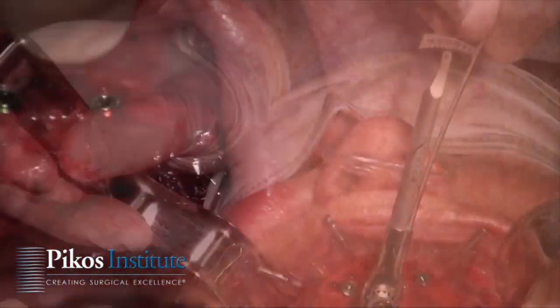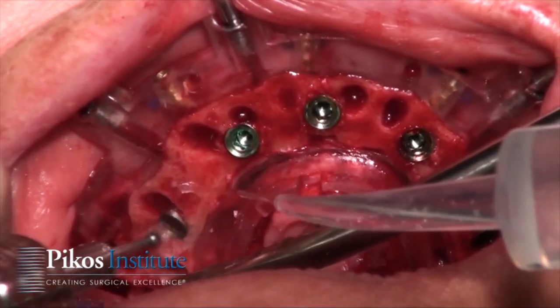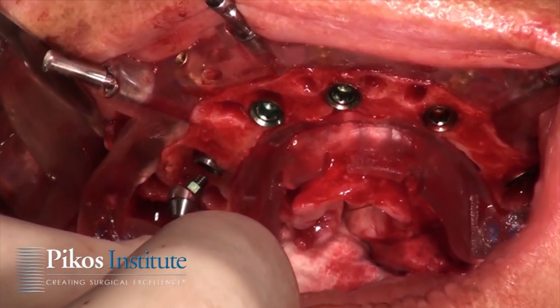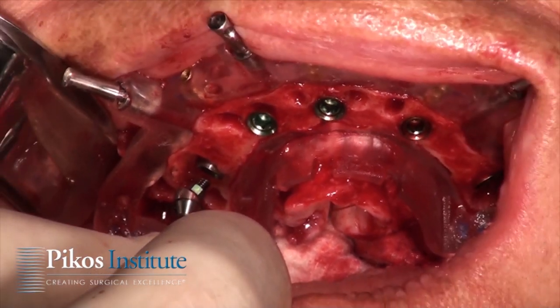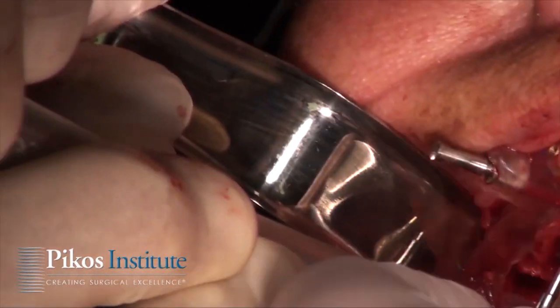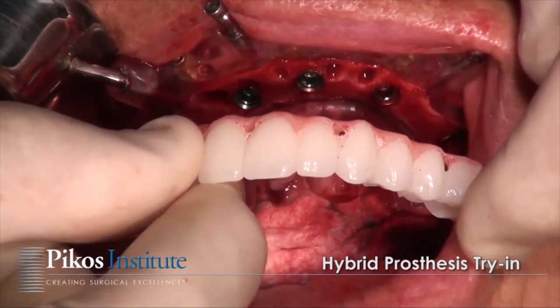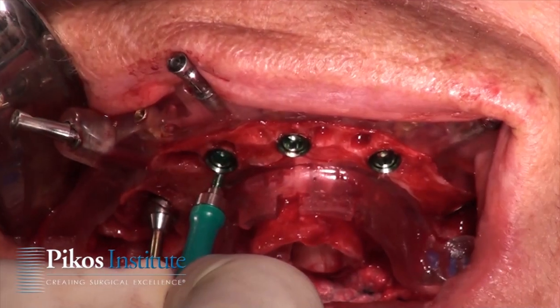And now the mounts are removed, the surgical guide is removed. We're just verifying the torques of these implants, and they're at least 35 plus Newton centimeters or greater. Bone reduction is done as we would typically do with our conversion cases. Multi-unit abutments are all selected in advance in terms of the specific type, including cuff height, etc. And you see the handles have already been shortened to allow for a very seamless experience here with this protocol. The workflow is very seamless.